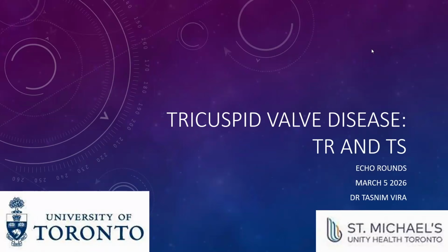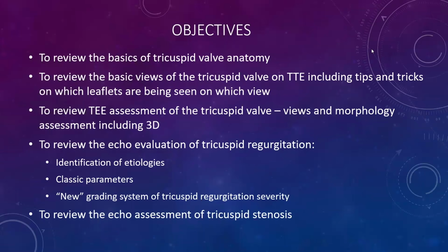So thank you very much for allowing me to be here to speak to you guys today. We're going to be talking about tricuspid valve disease. We'll focus on the tricuspid valve anatomy and then some of the basic views on transthoracic and TEE of the tricuspid valve, to help us look at this complex valve in a little bit more detail in terms of what we're looking at.